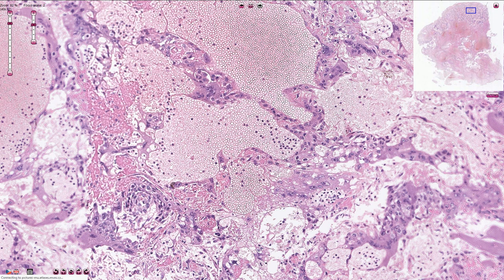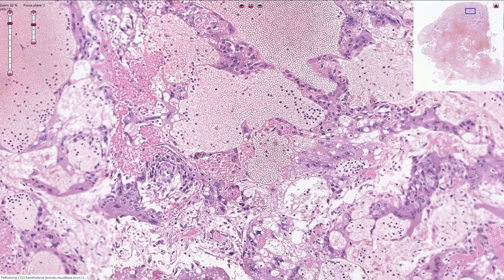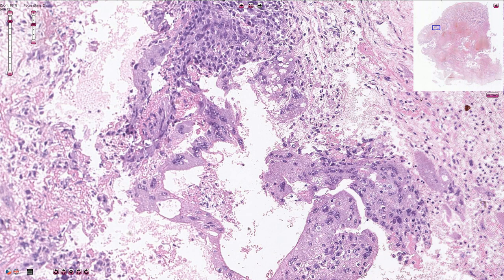Choriocarcinoma is commonly associated with hematogenous metastasis, which is quite logical because invading blood vessels is also the function of the normal invasive trophoblast. So once again, this is choriocarcinoma associated with atypical cytotrophoblast and syncytiotrophoblast.